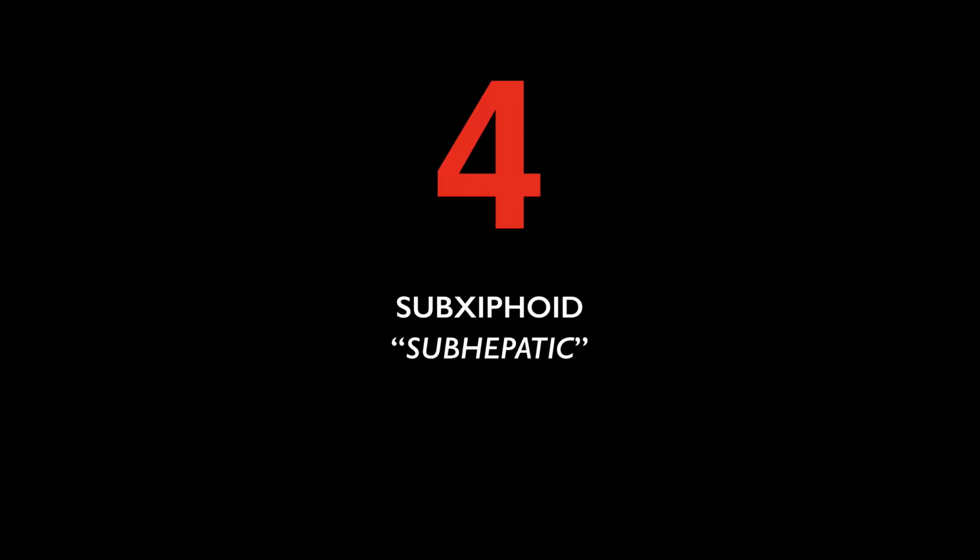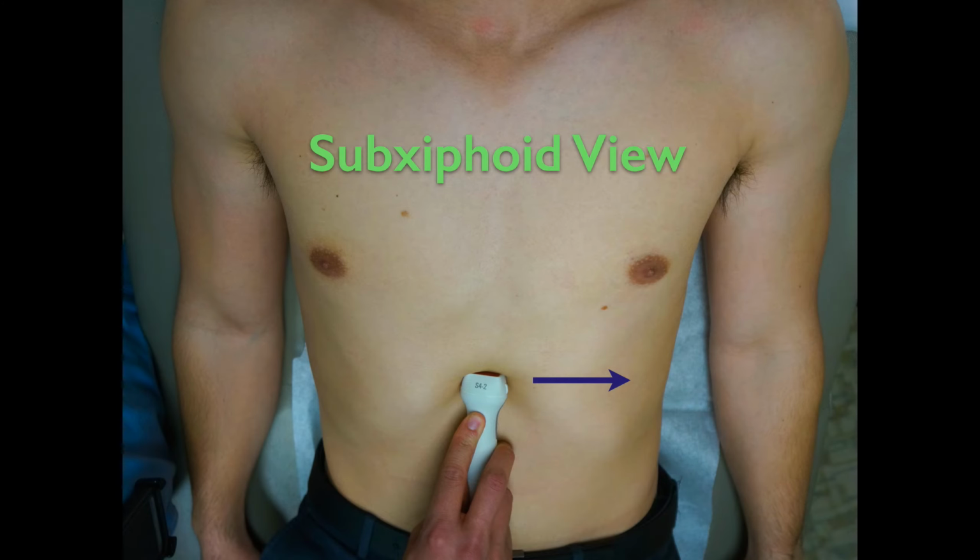The last view is going to be the subxiphoid view, or if you want to remember it, sometimes I call it the subhepatic view, just so you remind yourself that you really need to go through the liver to obtain this view. So for the subxiphoid view, once again, the indicator is going to be towards the patient's left side.